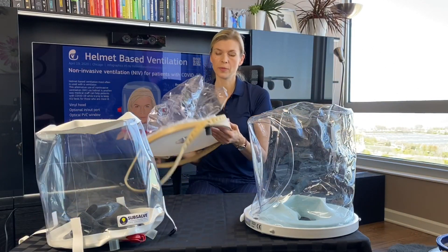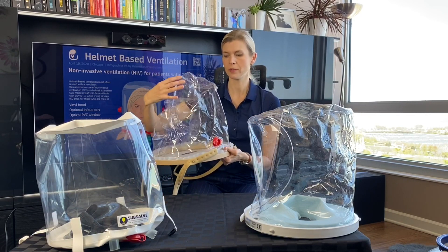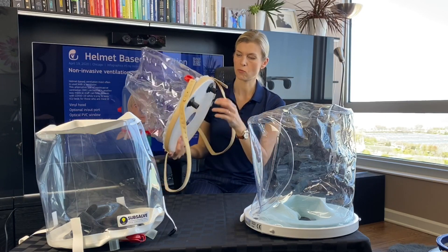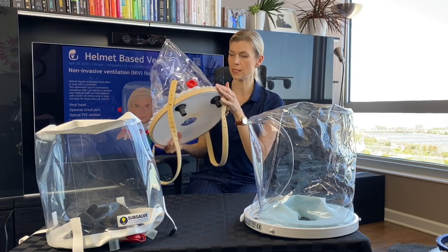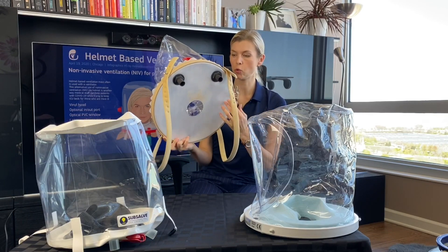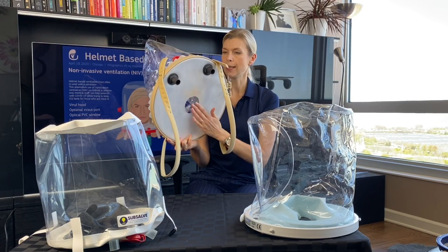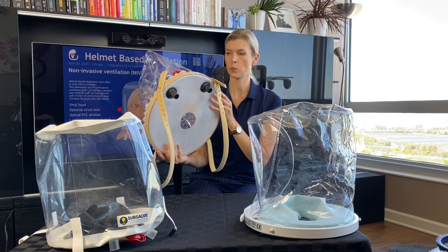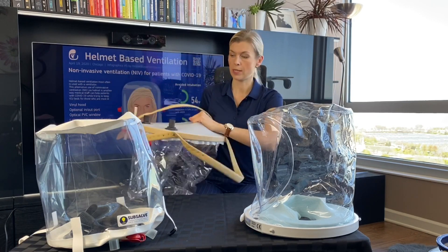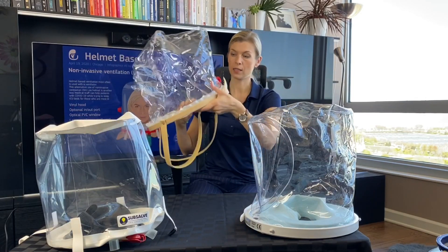Another company from Michigan, Extol, started making a helmet about a month ago and we've made some improvements already. I don't have the newest helmet here, but we did reduce the size of the ring and moved the neck opening closer to the back of the helmet, which helps prevent leaks and is more comfortable for patients. The silicone is very nice — it doesn't rip — and it can be used for non-invasive ventilation.